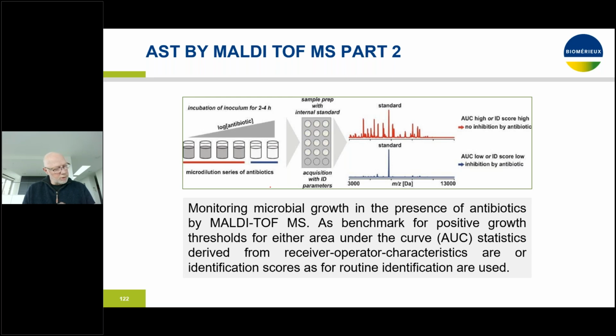And again, this entire antimicrobial hydrolysis method is a very nice method, technically speaking, but it is at this stage hardly suited for high throughput application in clinical settings. If you have 1 or 2 multi-drug resistant organisms in a week, then you may be able to do this. But if you really want to do this high throughput, then it's difficult.